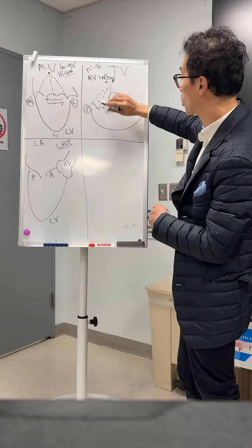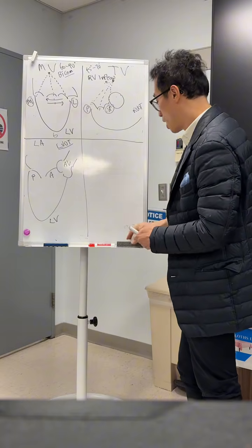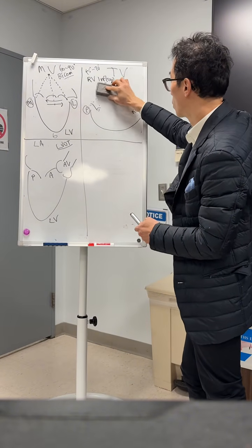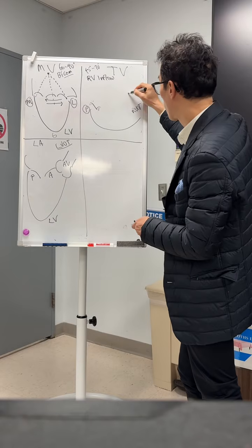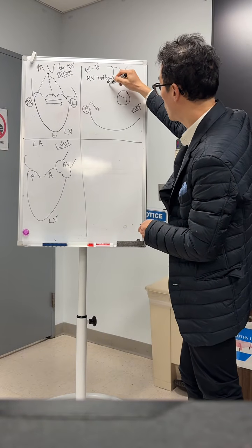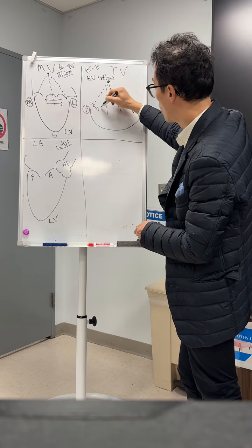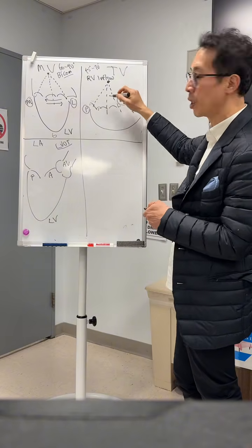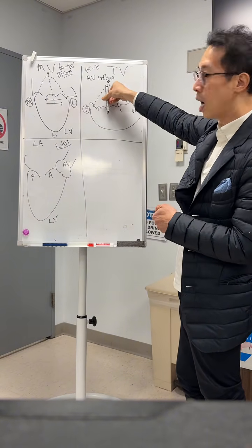That's why you need to what we call stand up the inflow view. When you stand up the inflow view, you then have the aortic valve shifted here. Your beam is now more center, and then you can beam in a more perpendicular manner because usually we're grasping at the center of the valve. So now you can see that I'm perpendicular.